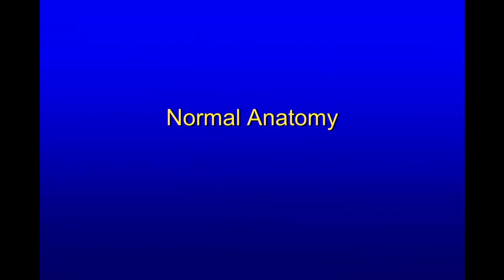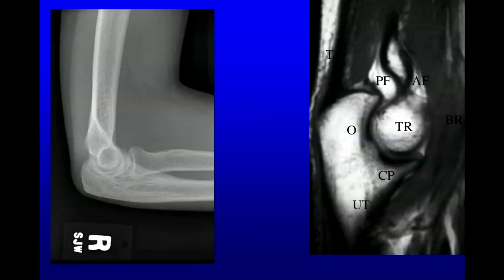Let's go over some normal anatomy. Here we have a lateral radiograph of the elbow, and we can see that in the distal humerus, we have a 30-degree angle with the distal portion, which includes the trochlea and the capitellum. The capitellum aligns with the radial head, and the trochlea aligns with the ulna.